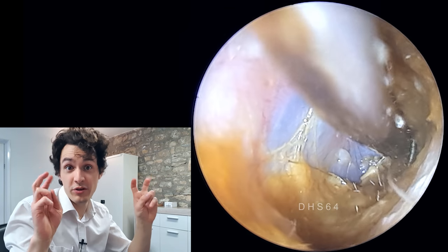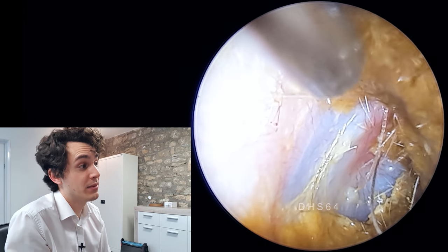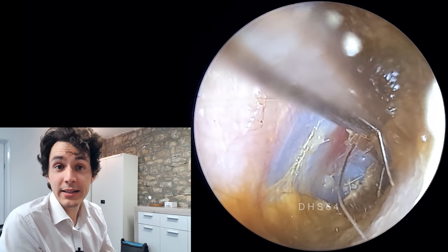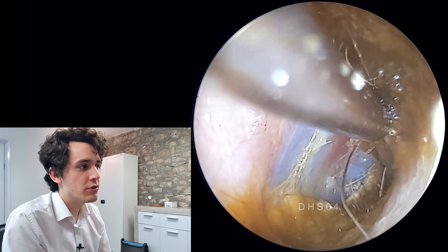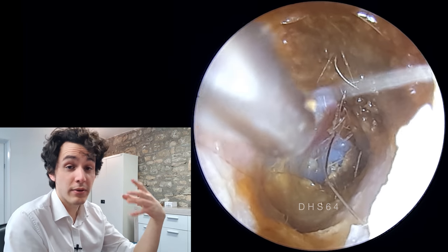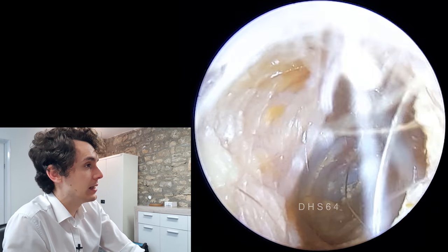Water is a cerumenolytic — that's just a fancy term which means it's a solution that can break down and dissolve earwax. Cerumen is earwax, and lytic — if you ever see lytic or lysis in a word — it usually means to break down or separate. So in this case: earwax separate, disintegrate, or dissolve. That's basically what cerumenolytic means.